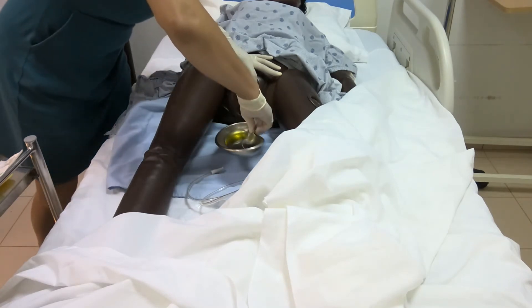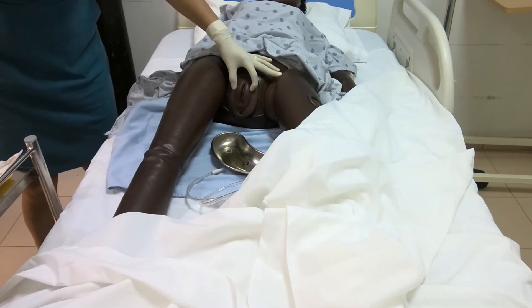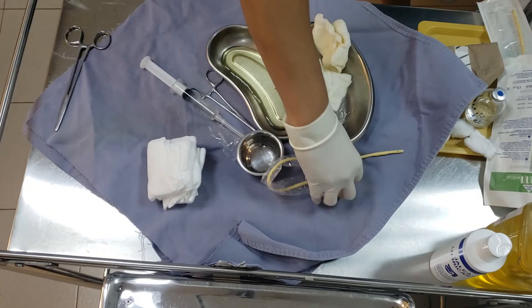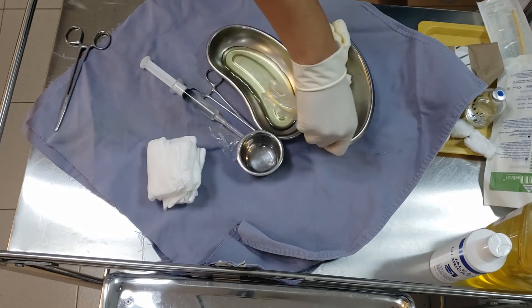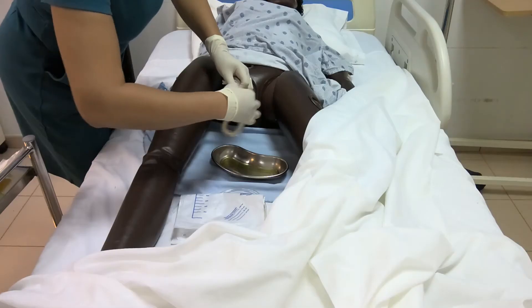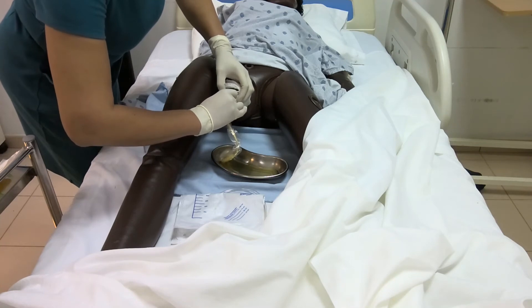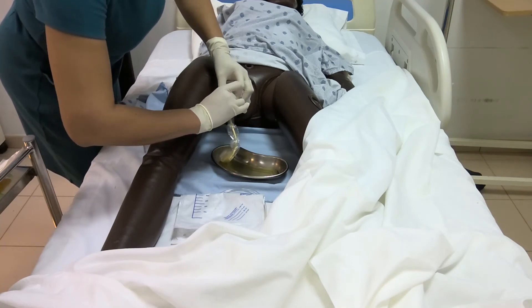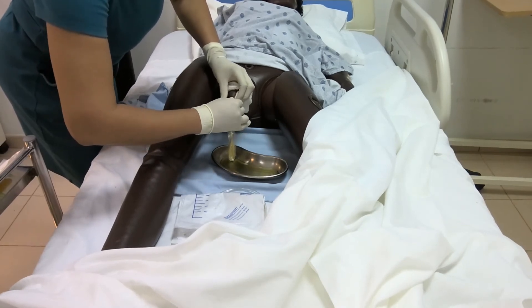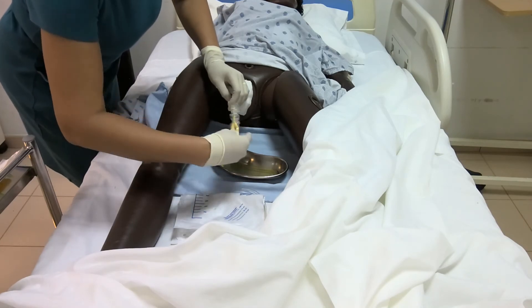Optionally, you can place one of the emesis basins from your sterile tray in between the patient's thighs to prevent soiling of the bedding. Lubricate your catheter up to 2 to 3 inches from the tip to aid with comfort of the procedure. Ask the patient to take slow, deep breaths and insert the catheter as the patient exhales. Slight resistance is expected as the catheter passes into the sphincter. You may need to rotate the catheter slightly until it relaxes.